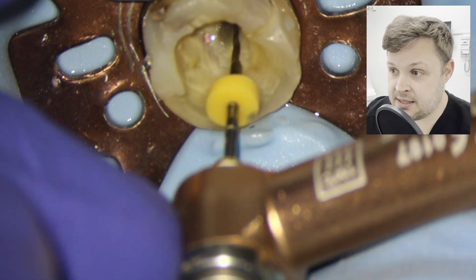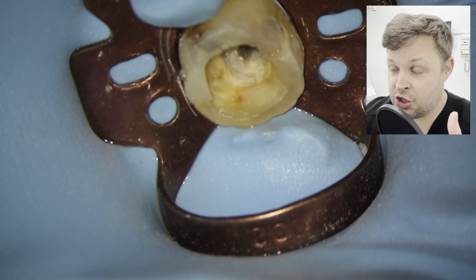Unusually in this case, when I pulled out the file in T mode — which usually doesn't fracture the file — I noticed that the end of the file is blunt. So straight away I'm thinking this file has fractured. It doesn't look quite like it did when I placed it in the mouth. I suspect the file is short, so I'm just going to measure it — and in fact it is short. I'm just going to look down the center of the tooth to see if I can visualize the fractured file.